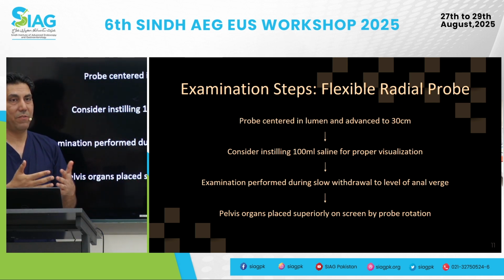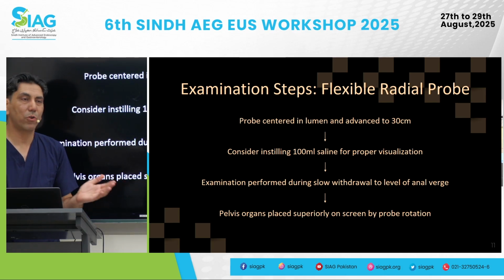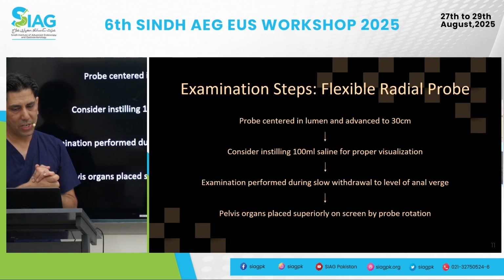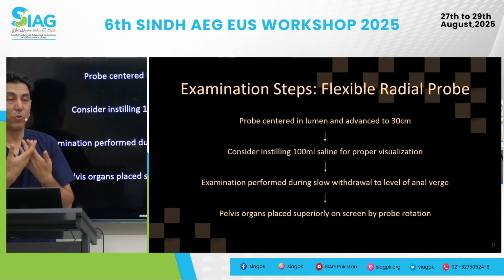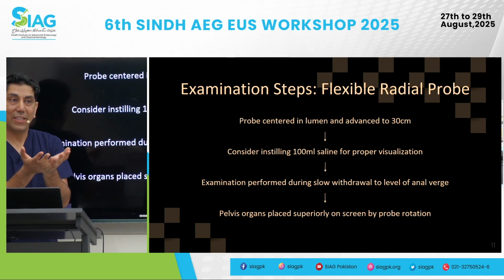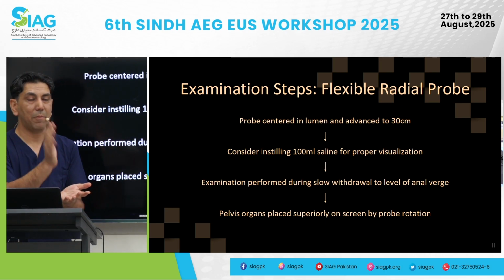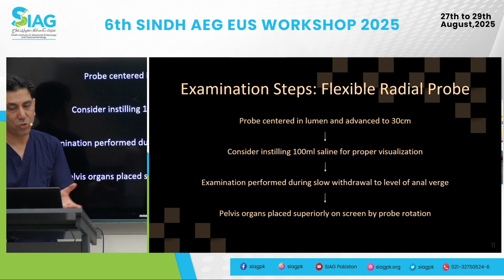Unless this is a patient where we have a suspicion of inflammatory bowel disease, then you can think about going into the sigmoid, but we're not going to be discussing that for the sake of discussion. We can instill some saline or water to improve your visualization. Obviously air is an enemy, and as we've talked about, it's all about coupling, maintaining good endoscopic EUS views throughout the scanning.